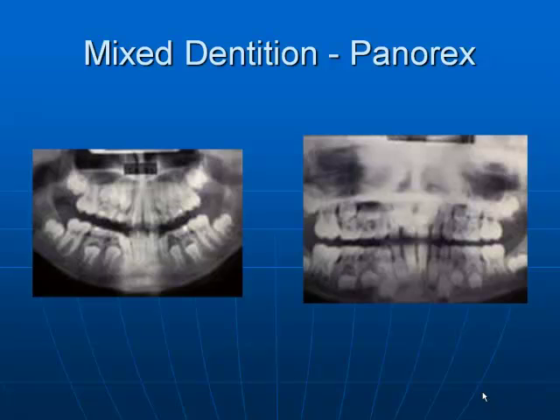Panoramic radiographs are often prescribed to supplement intraoral exposures. Panoramic radiographs do not image structures with the clarity of intraoral radiographs and do not reveal details like early carious lesions. Therefore, it is important to take a full mouth survey or a Panorex plus bite wings or periapicals.